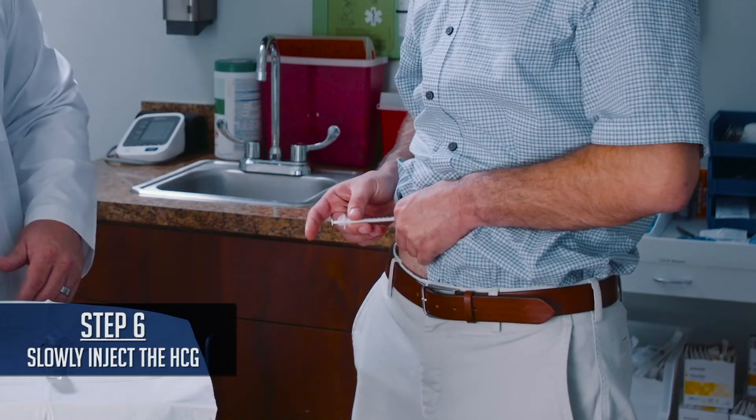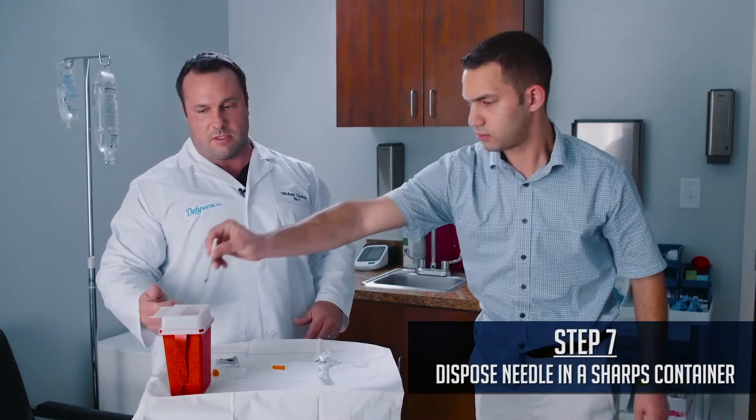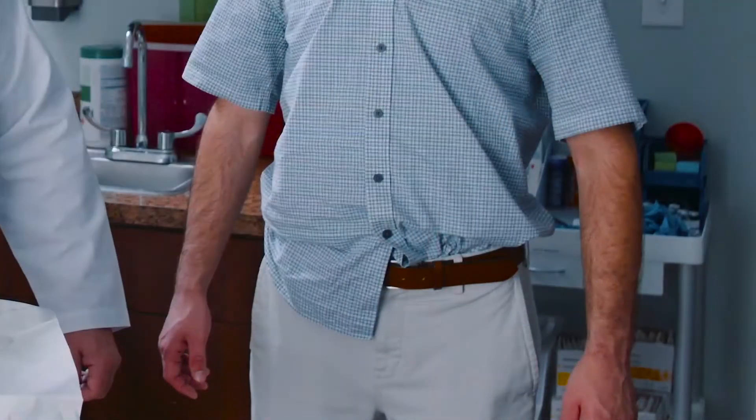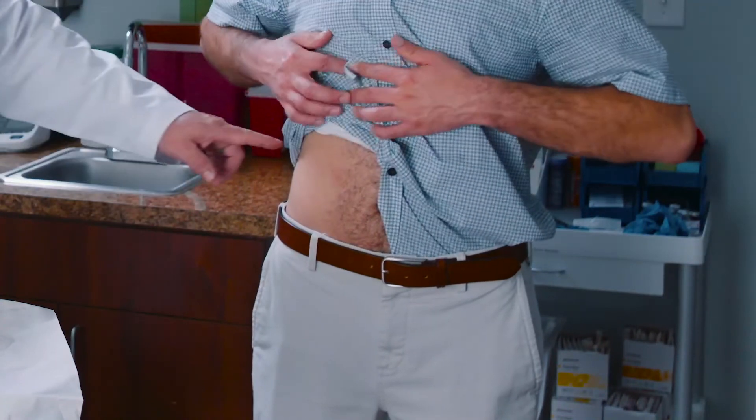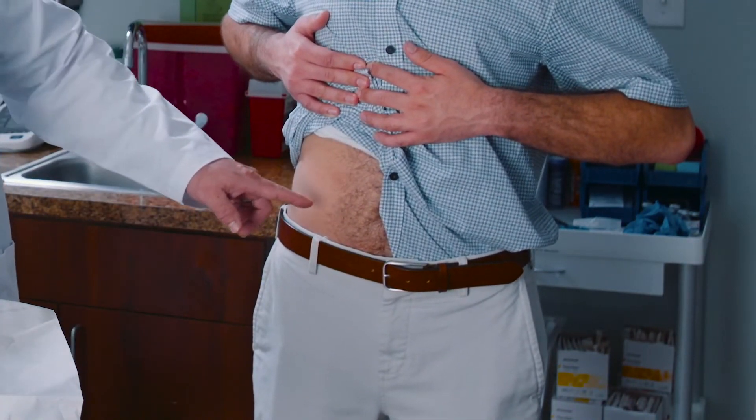After the injection, he's going to pull out and throw the needle away in the sharps container. The patient injected in the most common area, lateral to the belly button, about 3 to 4 inches.